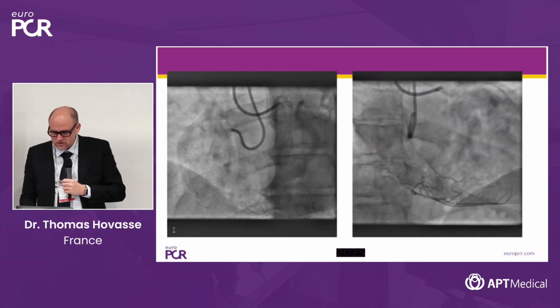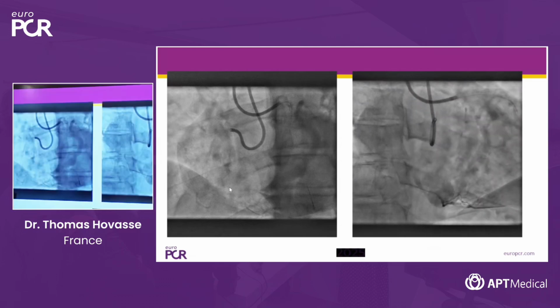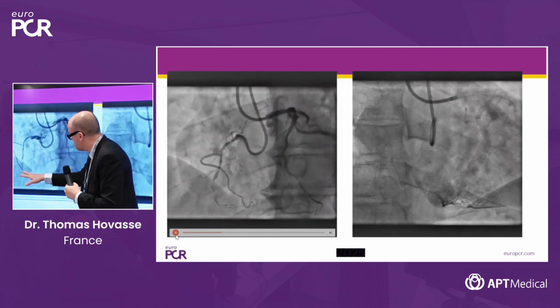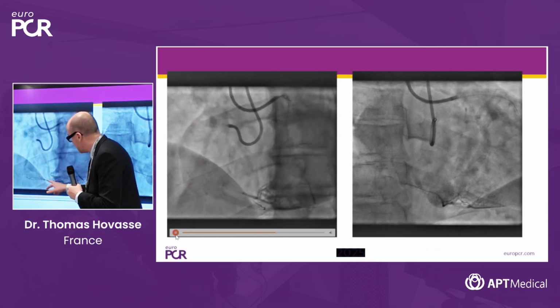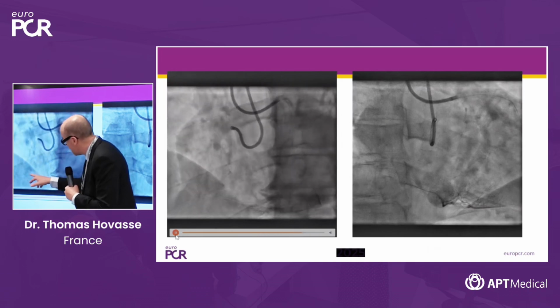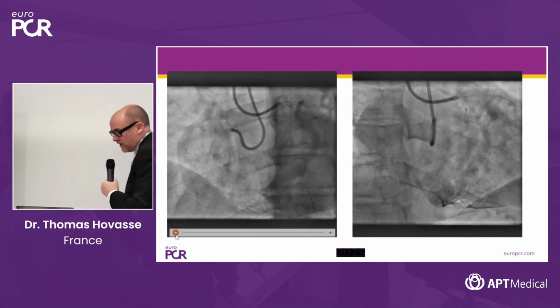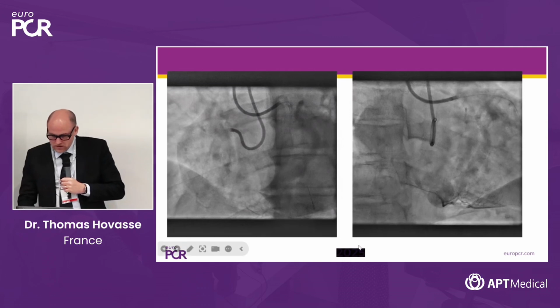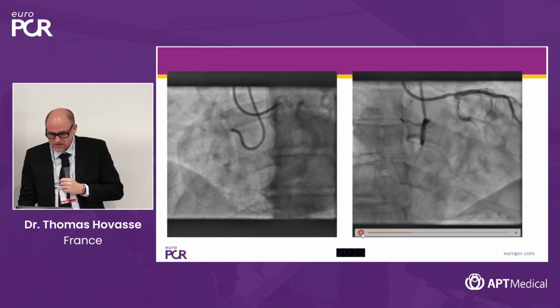So we've done this case last week. So again, a right coronary CTO. You can see the length seems so not so much ambiguity. We know we need to go like this, we need to go here, but somehow between the two, it's not so clear and maybe not so straight. But the technique at the beginning was almost the same.